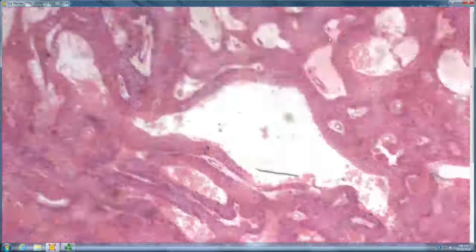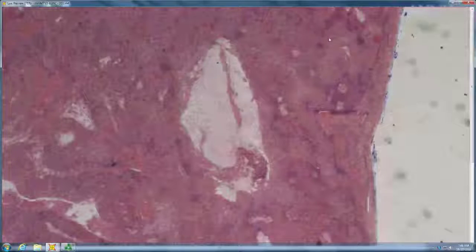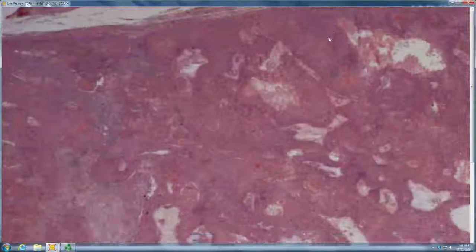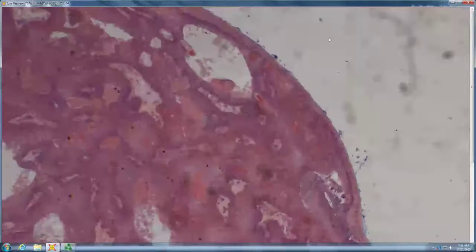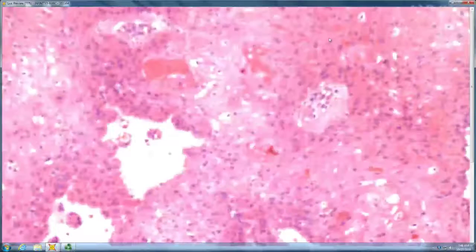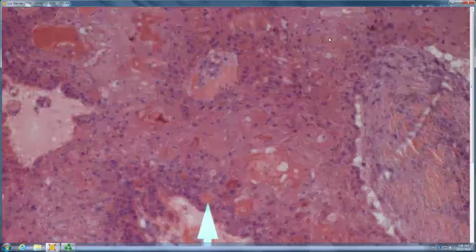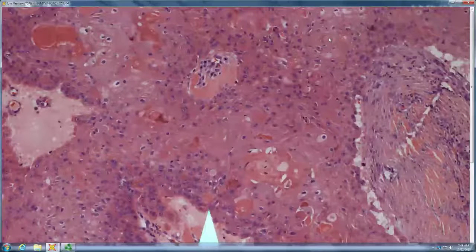Okay, so let us switch to the wonderful world of potpourri. That's probably a good one to start with. So it looks like, if there's maybe some ghost cells in there, maybe pilomatricoma. So it certainly rolls and scrolls. And so pilomatricoma, if these were basaloid cells that were keratinizing as ghost cells, are they basaloid cells keratinizing as ghost cells, or are they squamous cells undergoing abrupt keratinization? They're squamous cells undergoing abrupt keratinization. So this is proliferating pilar cyst. Very good. Same architecture, different cell type.